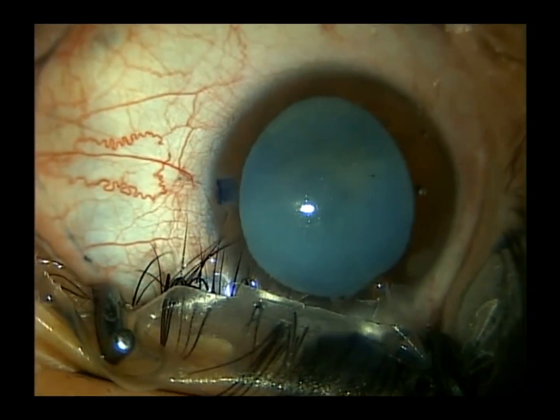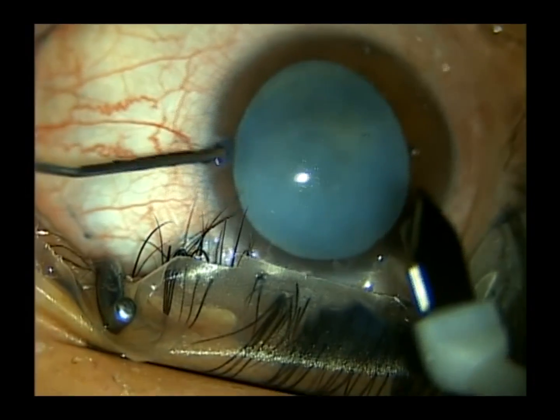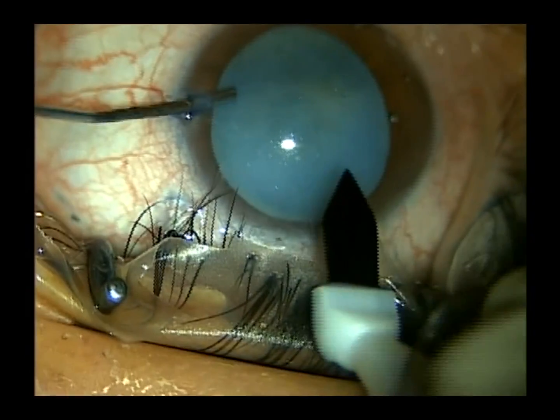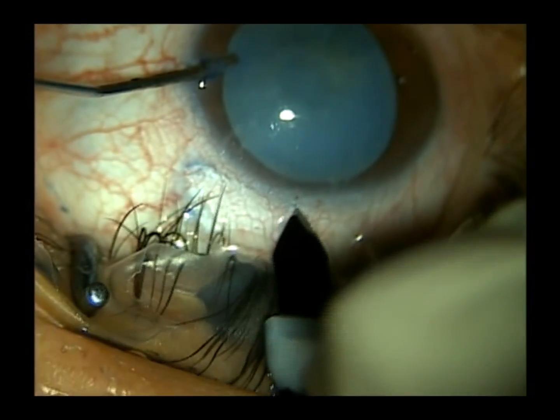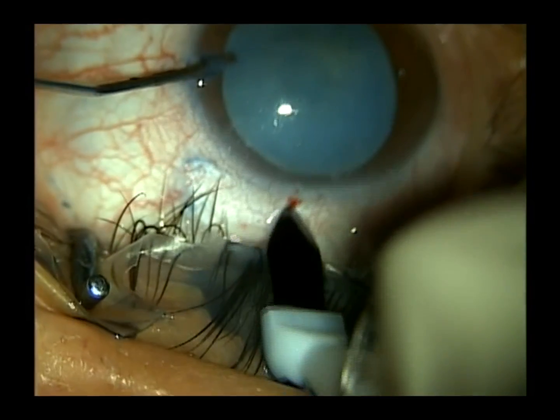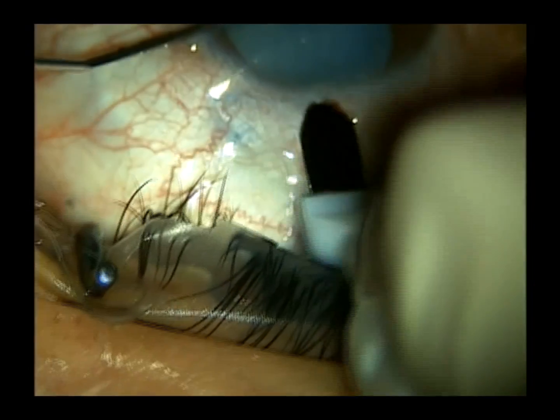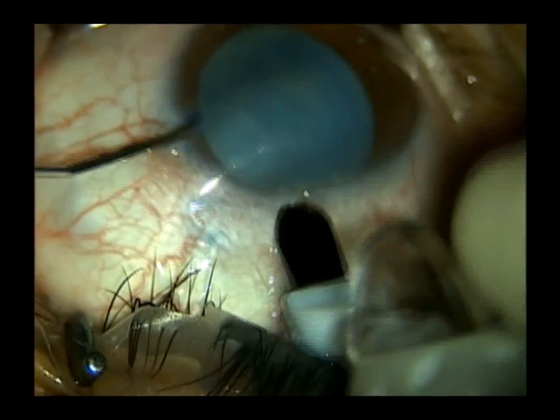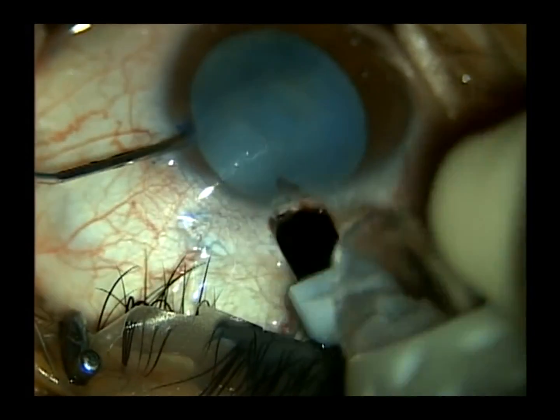This gentleman had some astigmatism at axis 90 degrees, so we chose to operate at 90 degrees to reduce his astigmatism. We've already created the conjunctival peritomy. I do use counter traction when I enter the eye, using my viscoelastic syringe.